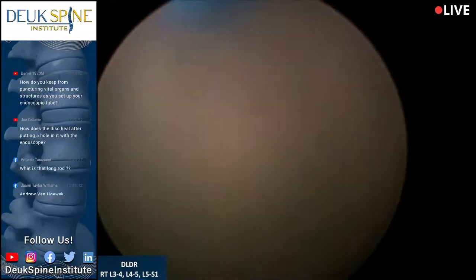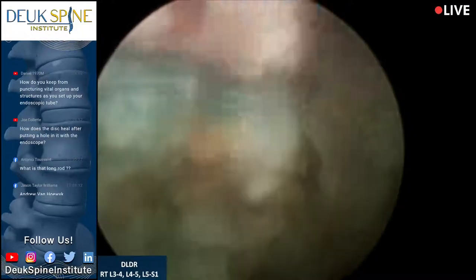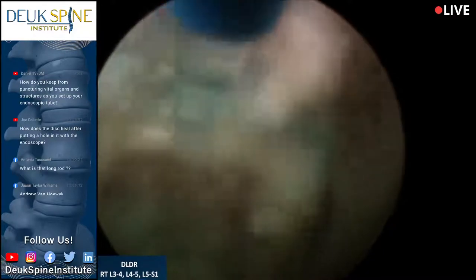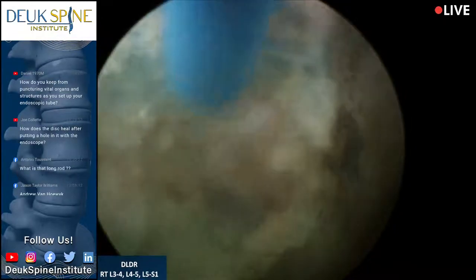All right, the yellow stuff here is fat. That's fat from the epidural space. That's not something we're interested in doing anything with, but it is billowing out, blocking my view, so I've got to deal with it. Best way to deal with it is with the laser. Just zap it a few times and that gets it out of the way.